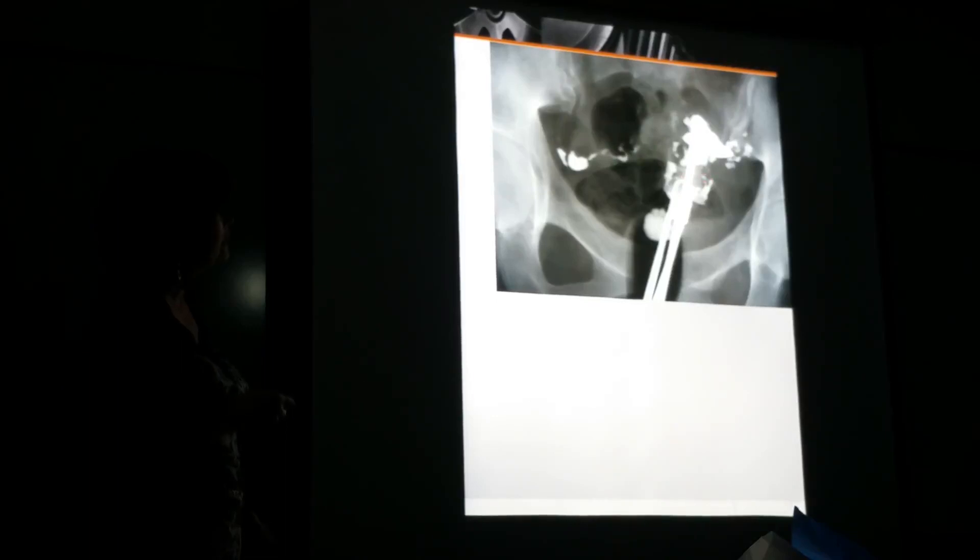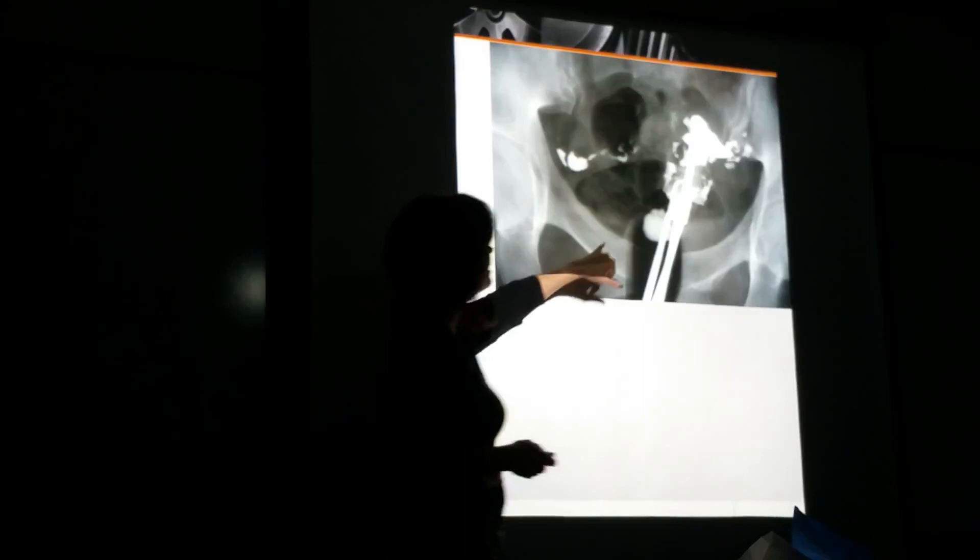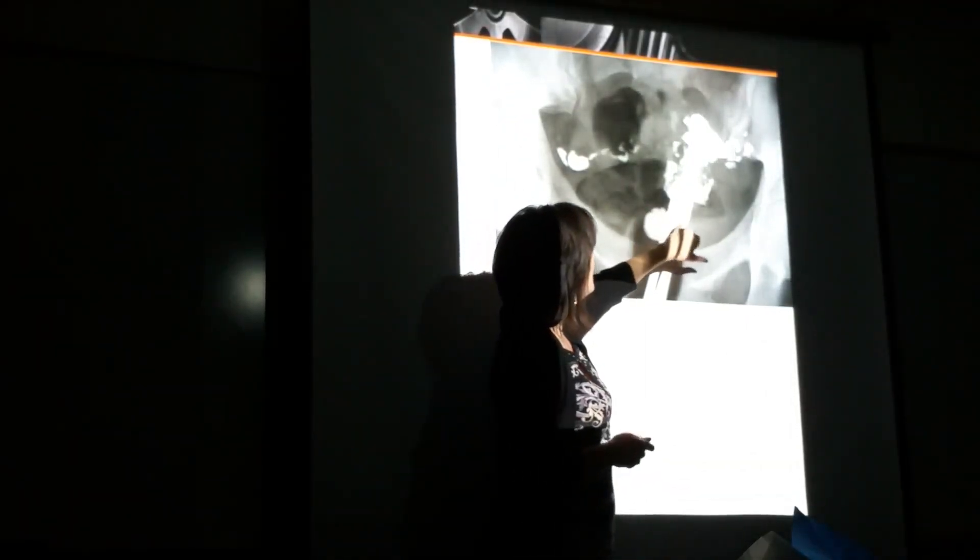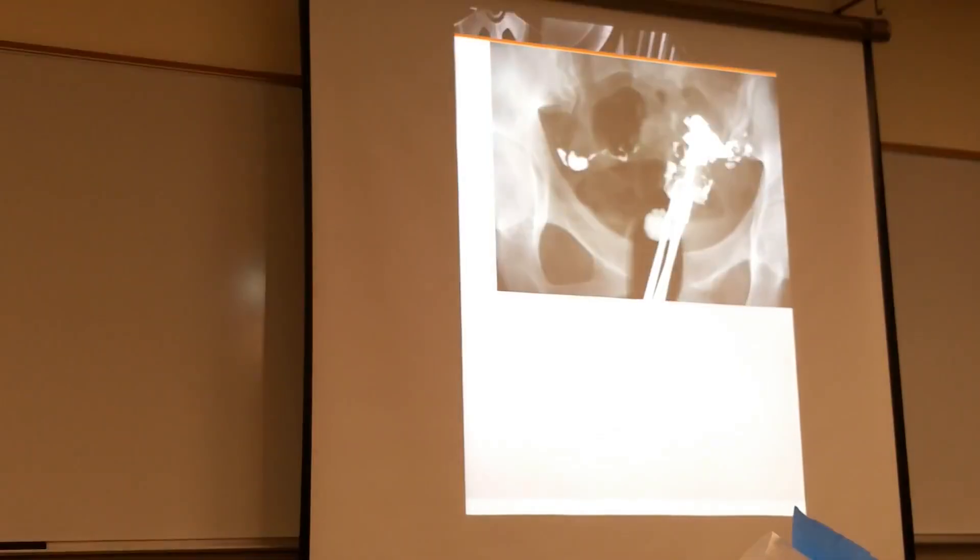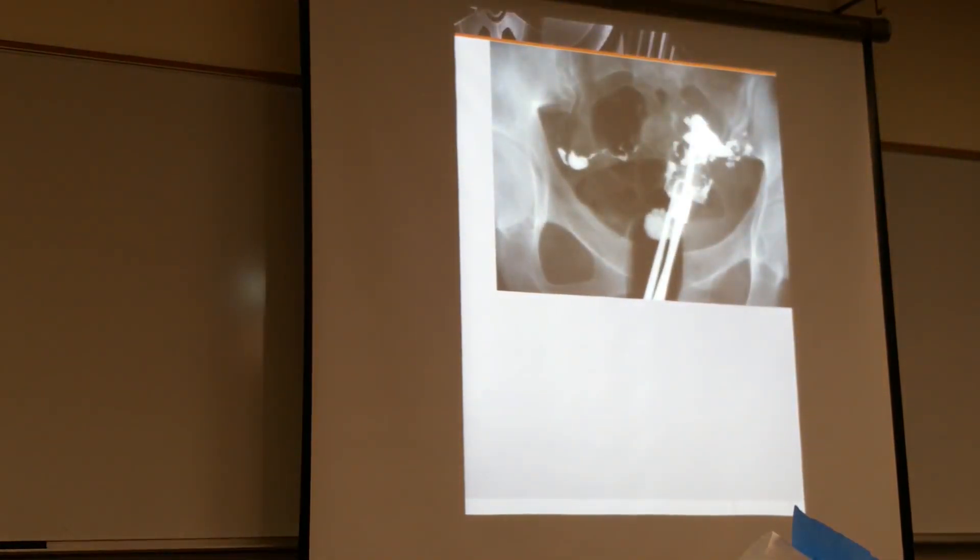Look at this mess. This is an oil-based contrast. Do you see the globules? You see the beading up? That's what happens when you have oil and water - they don't mix, it globs up. That's how you can tell oil-based contrast media, and it's very opaque. I can see some of it is coming down. Look how tilted that one looks. At an ultrasound this will be way over here, and the ovaries way over here somewhere.